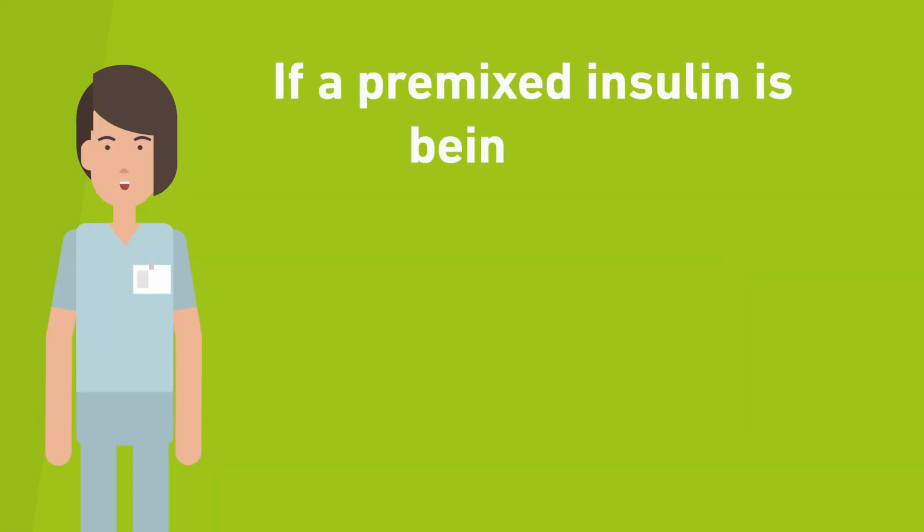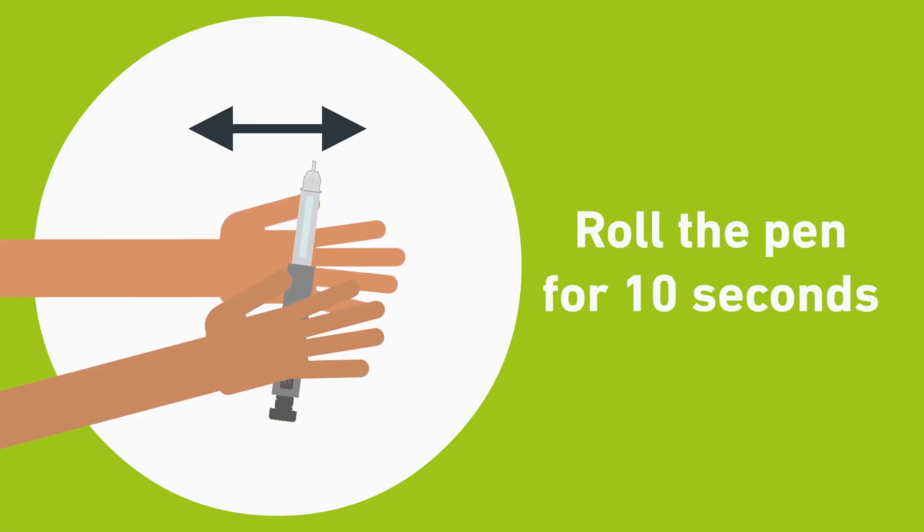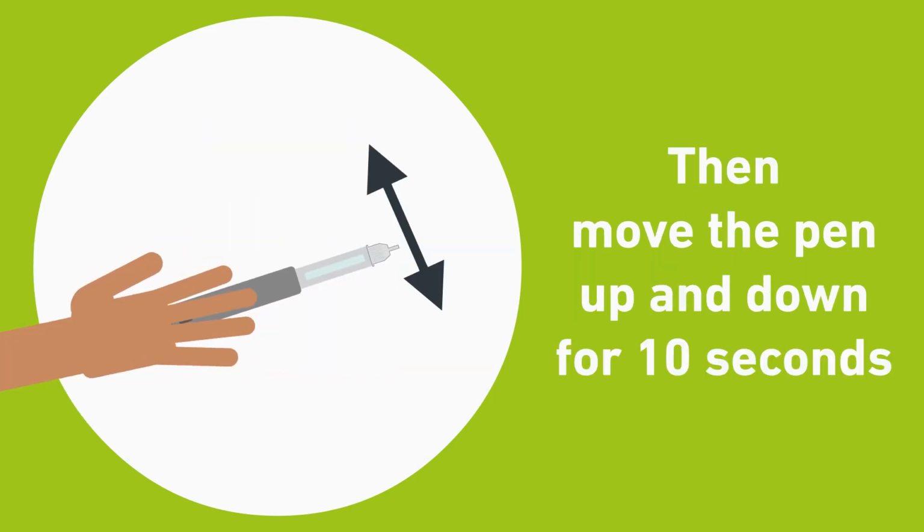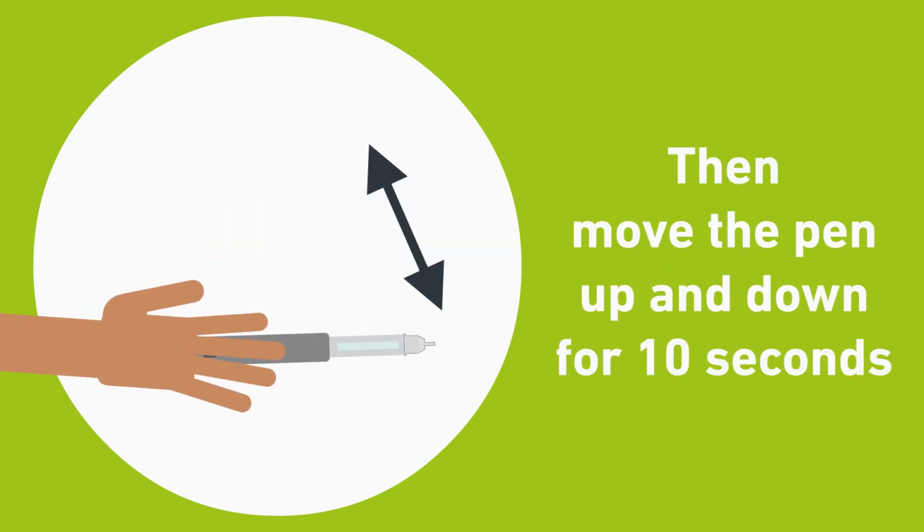If a pre-mixed insulin is being used, it is advisable to mix this to make sure both insulins are mixed together in order to maintain good blood glucose control.